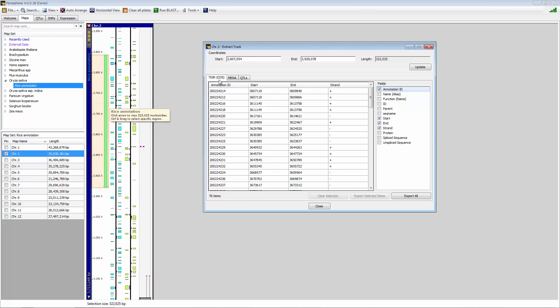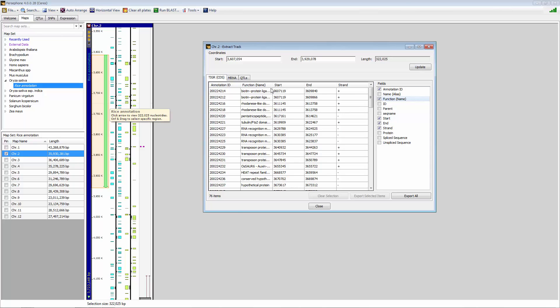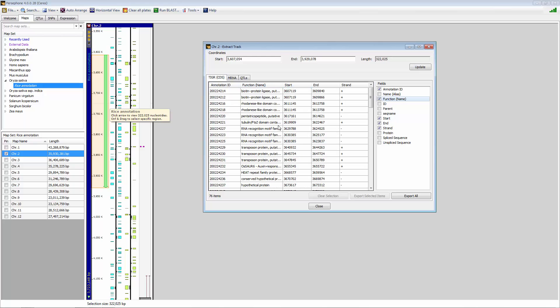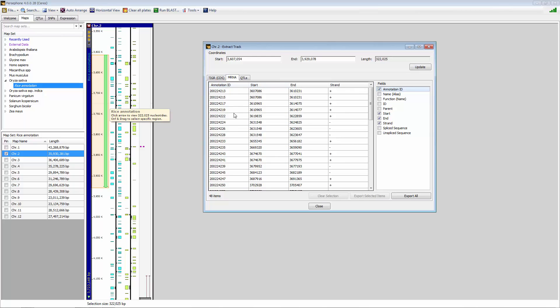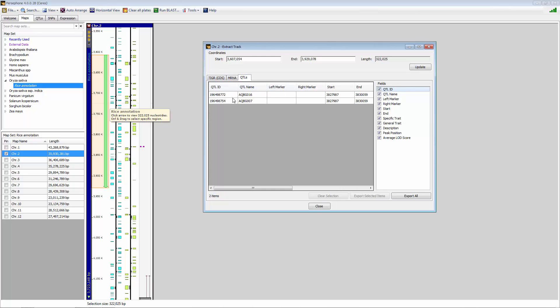So we have Tiger CDSs. There's 76 of those. Once again, we probably want to add function to that to give some additional information associated with these CDSs. And you can do the same thing for mRNA and also see what QTLs are in that region as well.